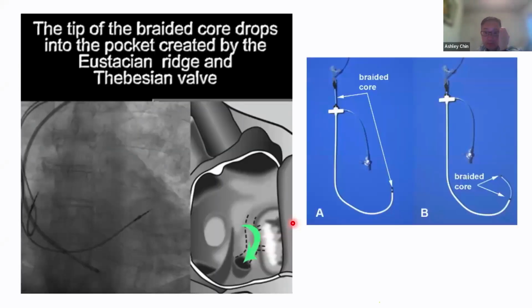Okay, all right, then some words about the Worley CSG system and the braided core system. What the system uses is a dye injection approach. There are no signals, so it's purely dye. It's got what we call an inner braided core, which is this blue catheter that fits through a 9 French outer CSG sheath. This sheath is quite nice because it extends right outside the skin. You use the same principles as what I've done, but the design of the CSG sheath is made to fall into the coronary sinus.